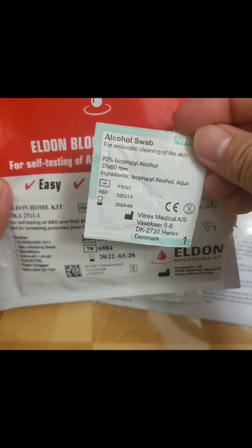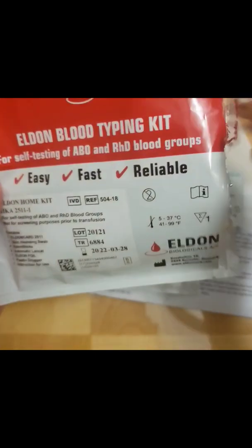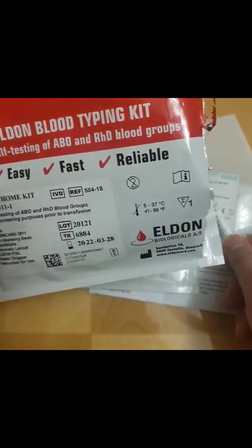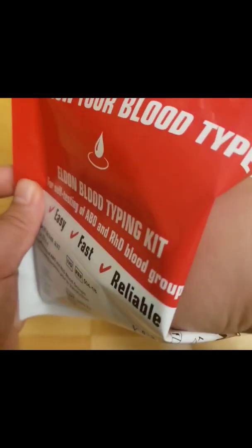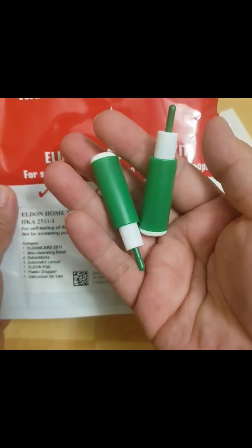The kit also includes an alcohol swab, Eldon sticks, a dropper, and two automatic lancets.